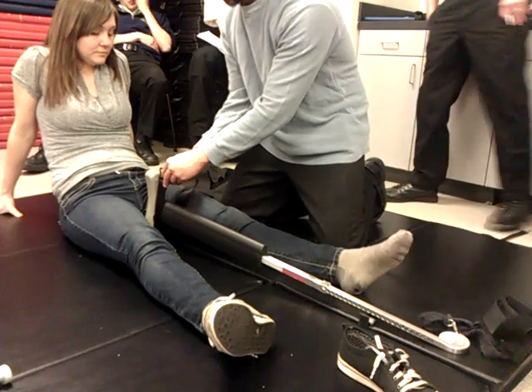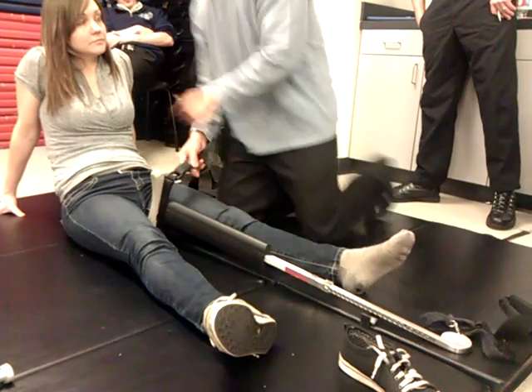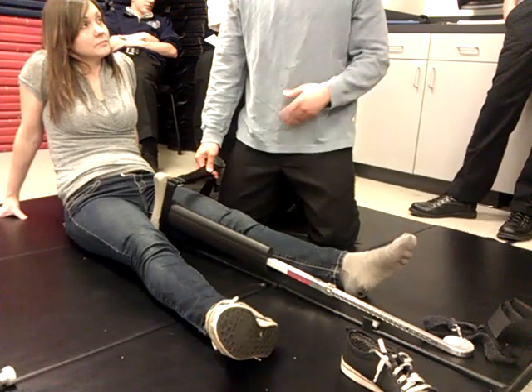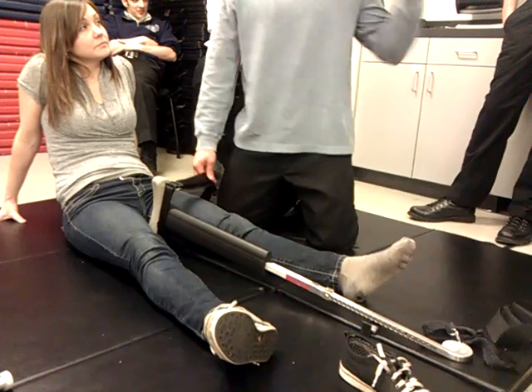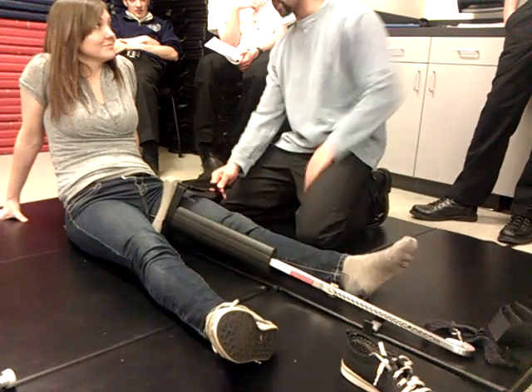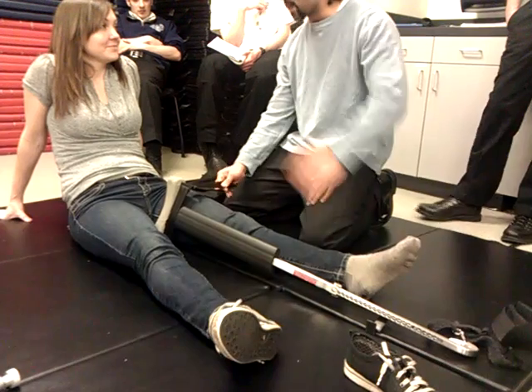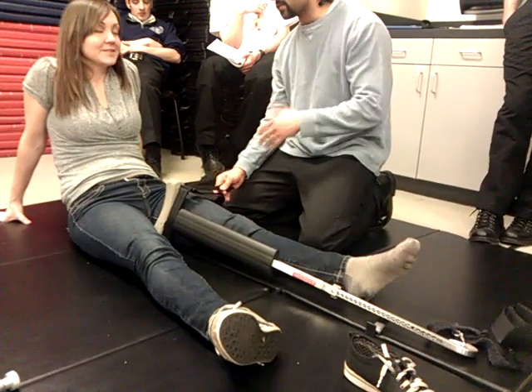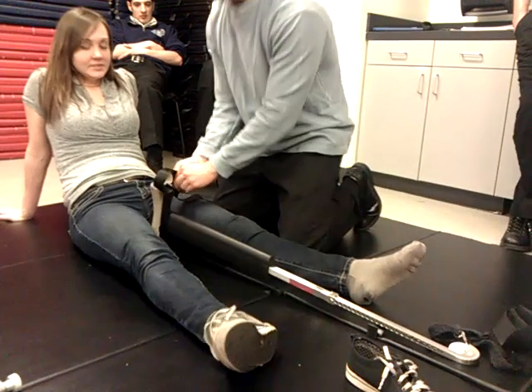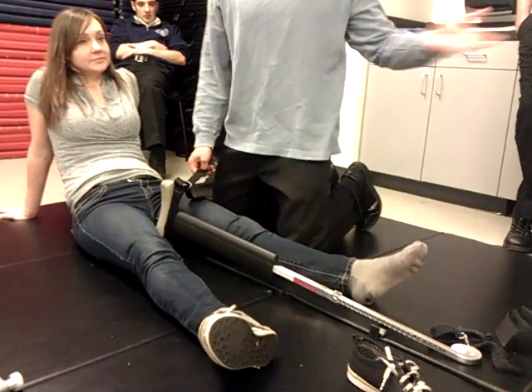Before you secure the strap, obviously, that's going to be a sensitive area for some people, right? So you're going to have to notify them there's going to be pressure on the area, and if they need to make any accommodations for it, then now would be a good time. Remember, you're going to feel some pressure on the inside of your upper thigh. Go ahead and let me know if it's too uncomfortable for you, and we can try and work something out. That's especially important for males, obviously, right? You can ask your patient if he feels the need to adjust at this point in time.